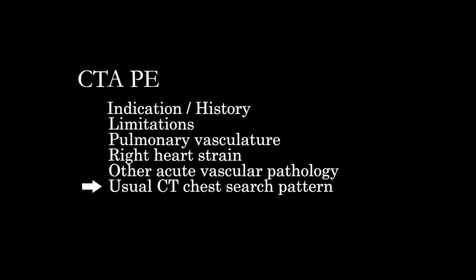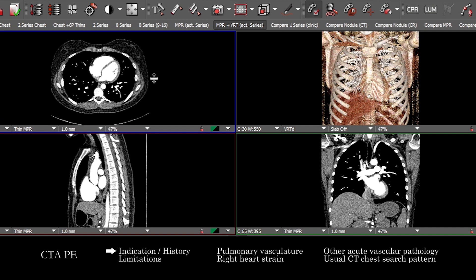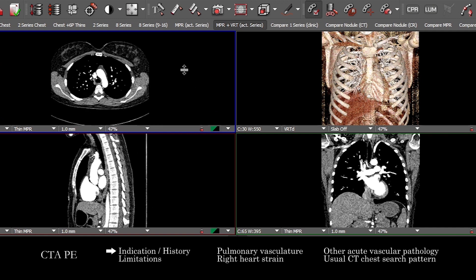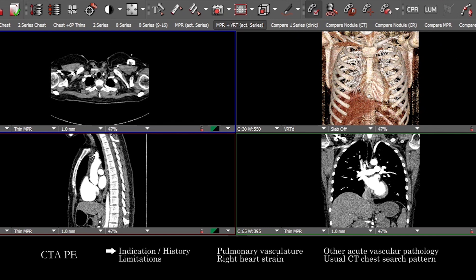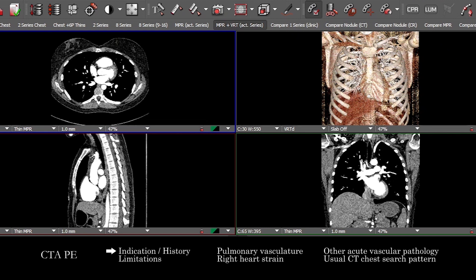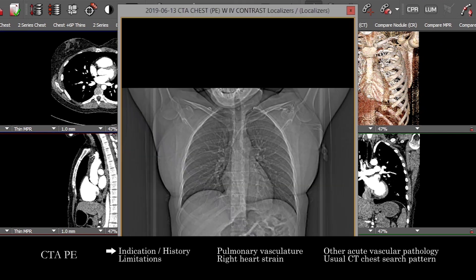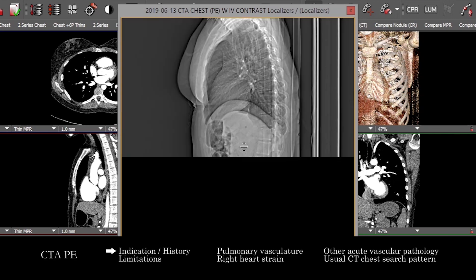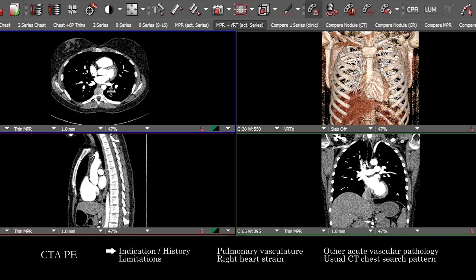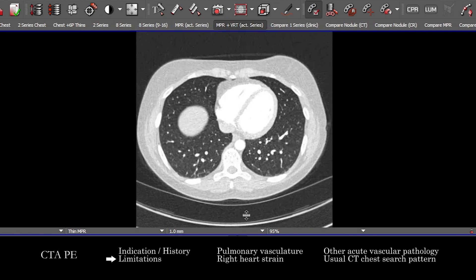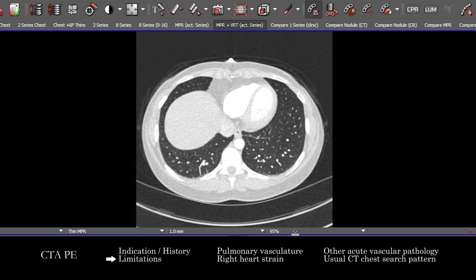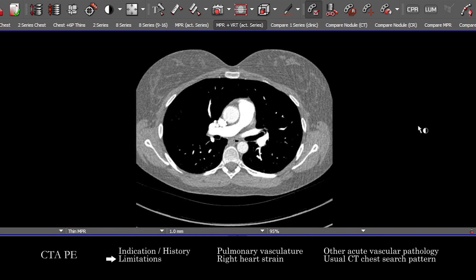I'll leave the finer details of the general CT chest search pattern to the dedicated video on the CT chest. Having taken a look at the clinical context, a good practice is to look at the localizers and remember to examine anatomy that may be outside the field of view of the cross-sectional images. Then take a quick look at the study attributes, looking for streak artifact, mixing artifact, and motion.